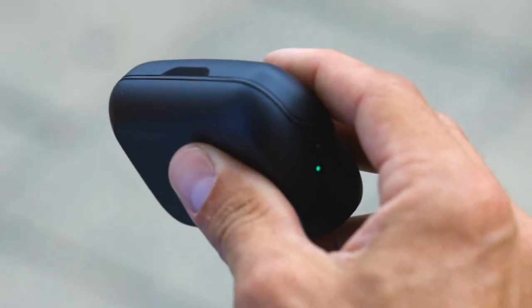The side light indicates case charge. When the light is red, the case holds less than one full charge for your IQ buds. When the light is green, the case holds more than one full charge for your IQ buds.